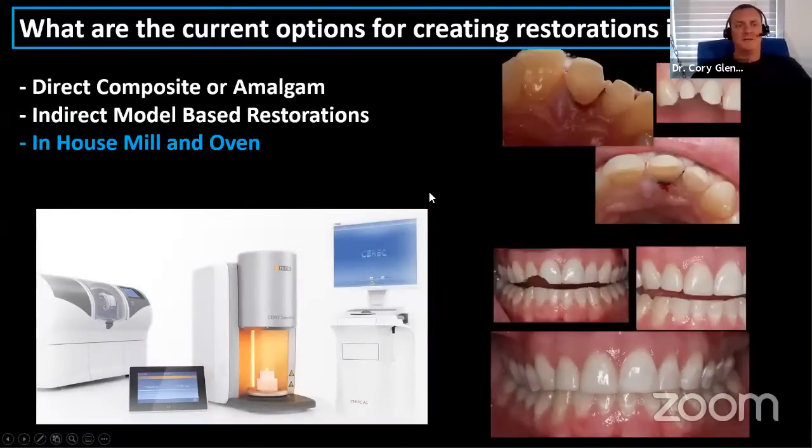Of course, if you're talking in-house dentistry, you have to mention CEREC. It's still the leading system for in-house milling, and it works great. I had one in my own practice and I used the heck out of it. The obvious disadvantage is that it comes with a huge price tag, so that may not make sense for all practices. In addition to that, there are other mills.